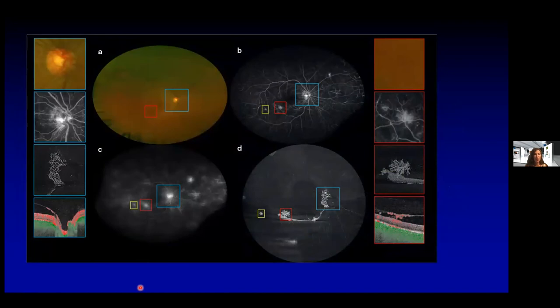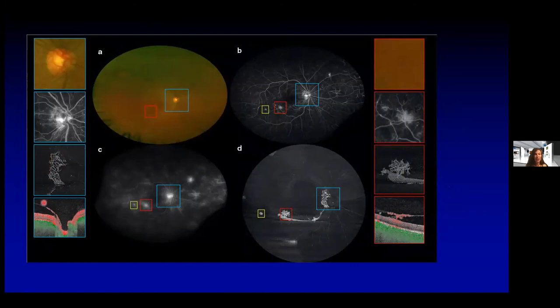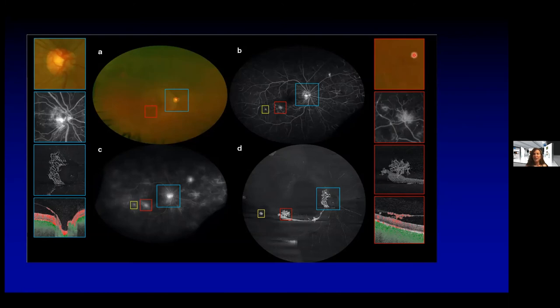Here's a patient from the study who had visible neovascularization of the disc — on the upper left is the color fundus, here's the corresponding fluorescein angiogram, and here's the corresponding OCT angiogram. We can see very obvious neovascularization of the disc. Looking at the flow overlay in this region, we can see it's red, consistent with vascular flow. Here's also an area of neovascularization elsewhere that was seen clinically, with the fluorescein and OCTA side by side, and the flow overlay confirming it.